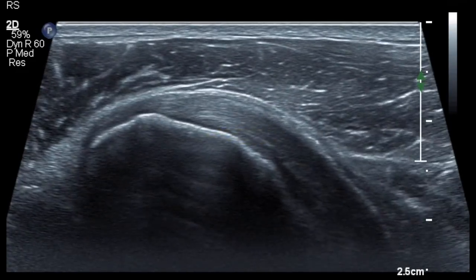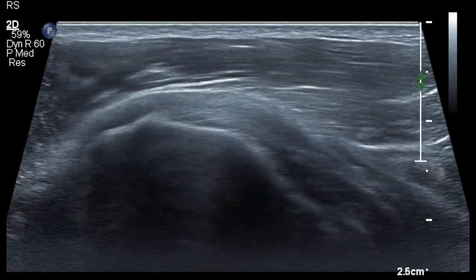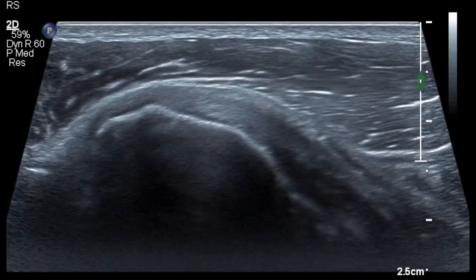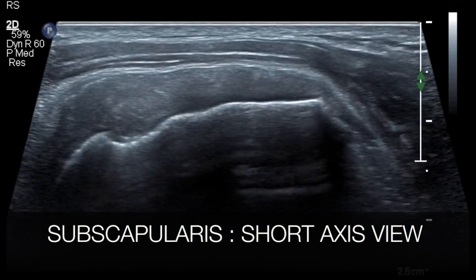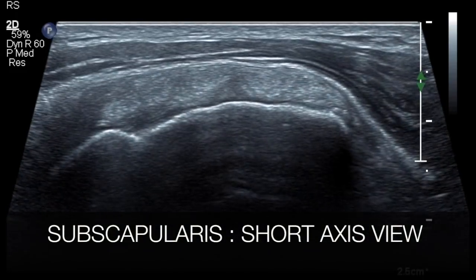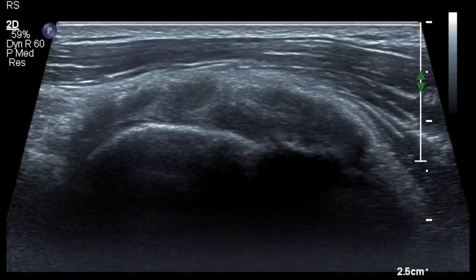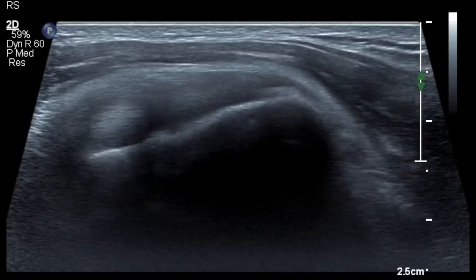The subscapularis can also be imaged in a short axis by moving the probe longitudinally, and you can appreciate the multipennate appearance of the subscapularis tendon in the short axis view.